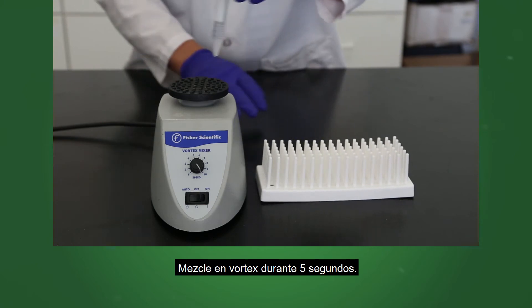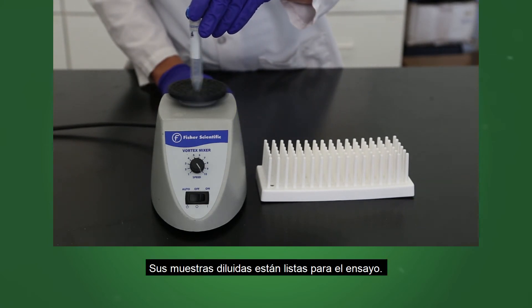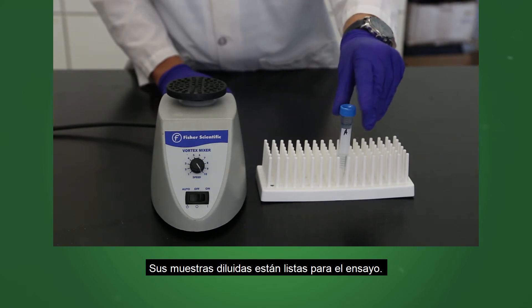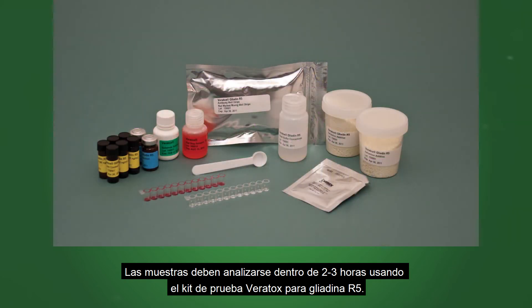Mix by vortexing for 5 seconds. Your diluted samples are now ready for the assay. Samples should be analyzed within 2 to 3 hours using the Veritox for Gliadin R5 Test Kit.